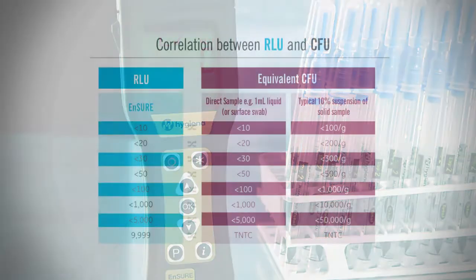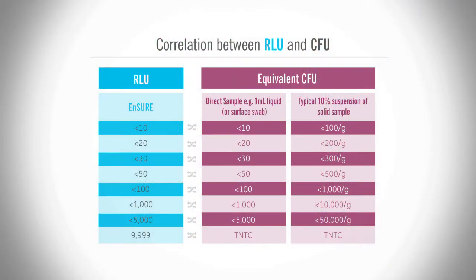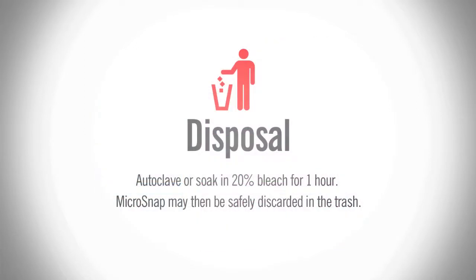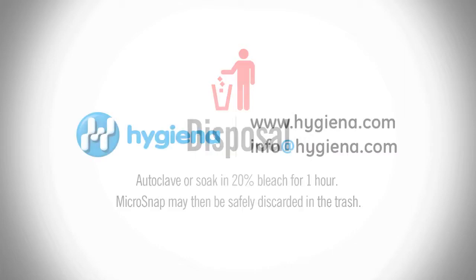For interpretation of results, refer to the table in the MicroSnap kit insert to determine the equivalent CFU levels detected by MicroSnap. To properly dispose of MicroSnap, disinfect the devices by autoclaving or soak in 20% bleach for 1 hour. MicroSnap may then be safely discarded in the trash.